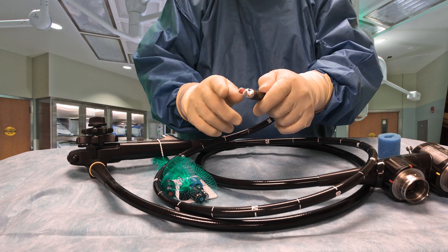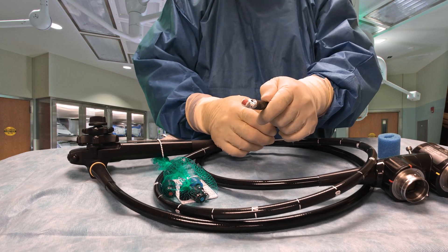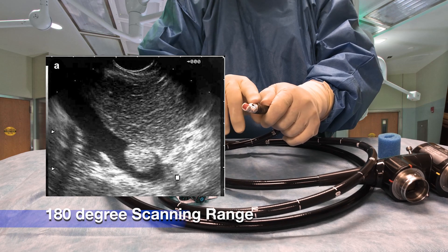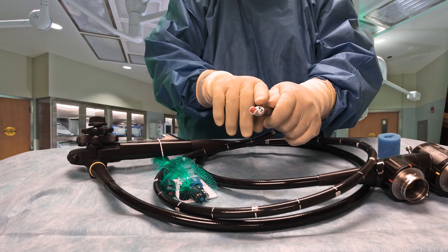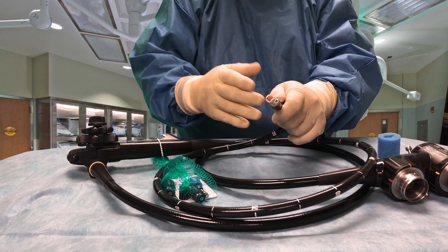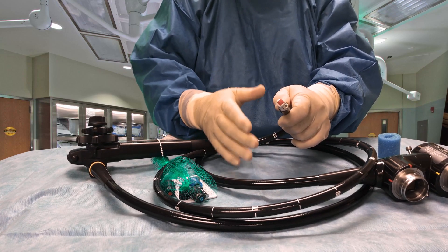The transducer looks one way and gives you a kind of a pie-shaped image. The video camera at the end here looks kind of straight ahead and over the transducer, and it gives you a normal high-definition video image.